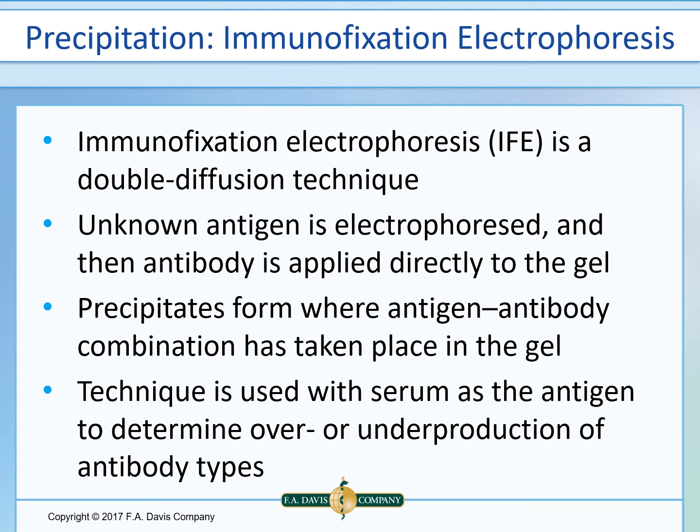Immunofixation electrophoresis has similar properties as immunoelectrophoresis, except that after electrophoresis takes place, antiserum is applied directly to the gel surface rather than placed in a trough. Agarose or cellulose acetate can be used for this purpose. Immunodiffusion takes place in a shorter time and results in higher resolution than when antibody diffuses from a trough.